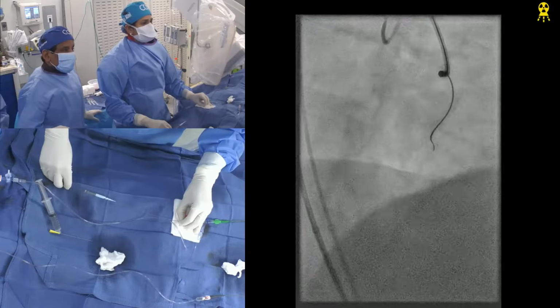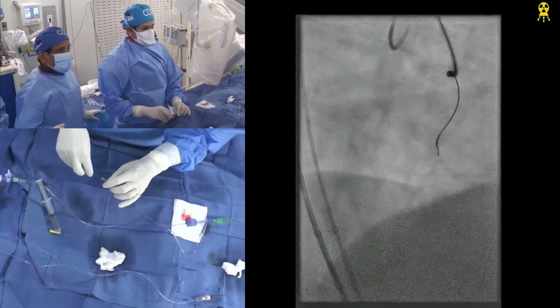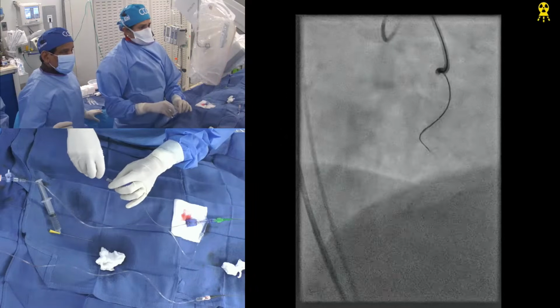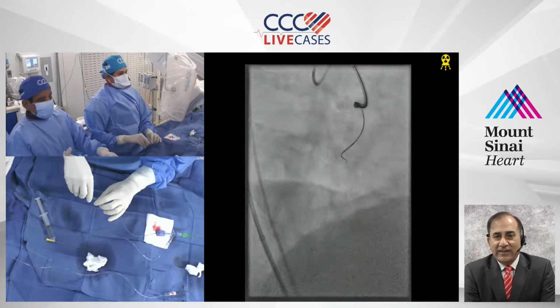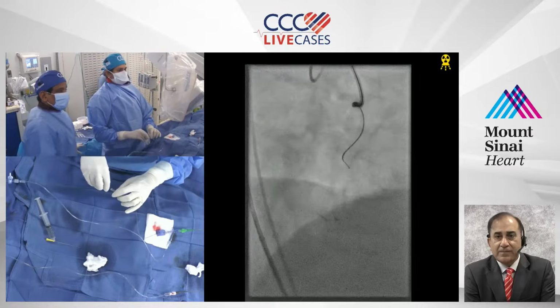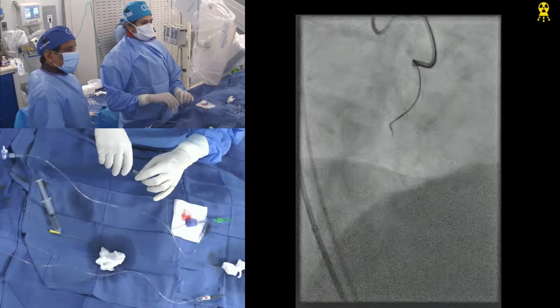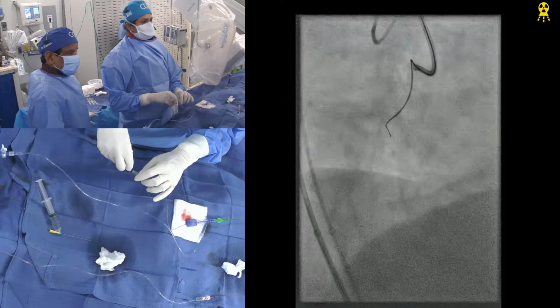The thing is, when you are in the RAO view, you don't know if your guide is coming out. That's the biggest issue with the RAO view. I cannot remember more than a handful of cases where we have been showing the RAO view, but in this particular case, clearly beneficial. Okay, I think I have. Although sooner or later you'll go back to the LAO, I think. Once there's a little progress, then we go to Gaia, right? I think we are in that area.